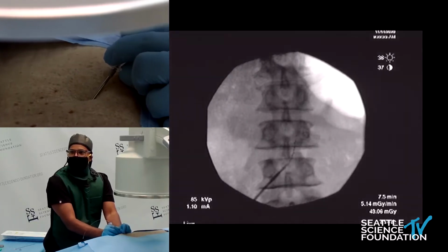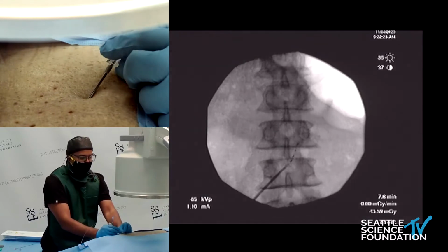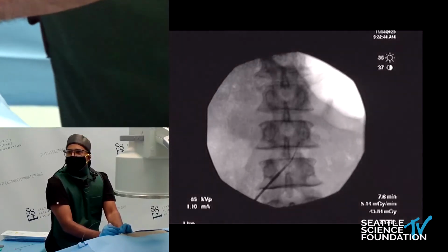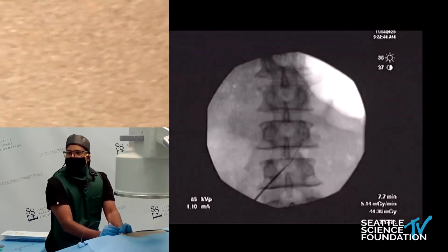There's quite a bit of fibrosis I can feel in this cadaver, but that's what you get. And so what I'm doing is I'm really working my way out towards the pedicle. I'm starting to rotate over, and you can see now I'm starting to duck underneath that pedicle. Justin, if you don't mind collimating a little bit further over that L3 DRG.